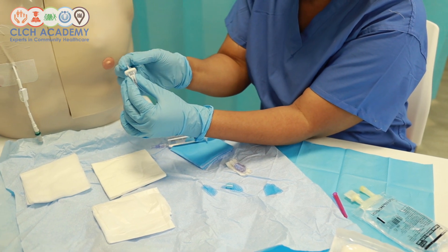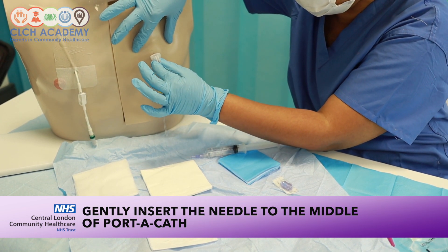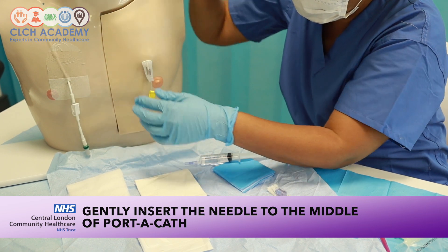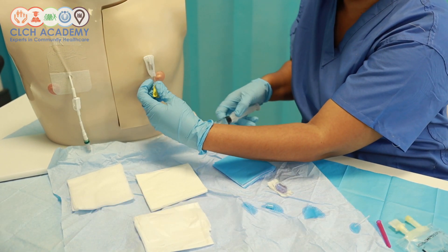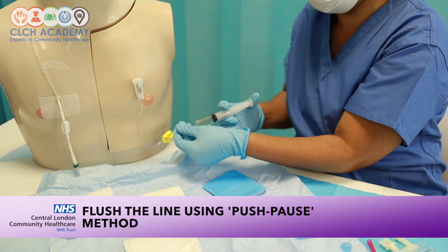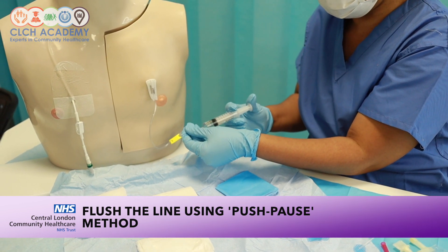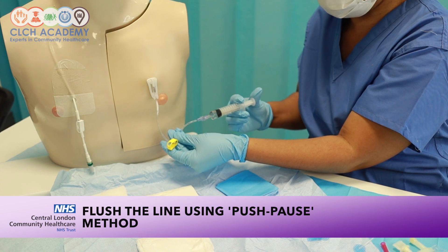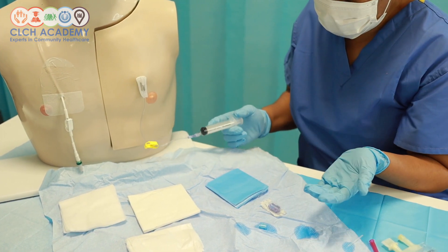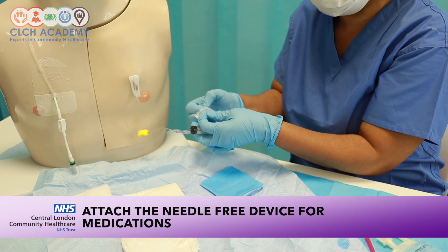I'm going to frame the port again, remove the sheath, and gently introduce the gripper needle to the centre of the portacath without contaminating the cleaned area. I'll release the clamp and use the push-pause technique to flush. The line is flushing easily — push pause, push pause — flushing approximately 10ml in total, ending with a clamp on positive pressure. If medications were needed, I'd now attach a needle-free device ready for medication insertion.